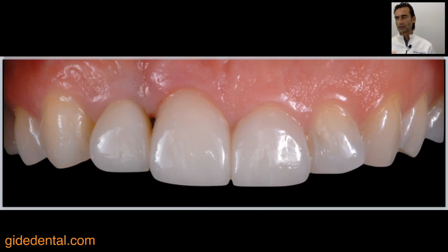clinical condition, you can see here the central incisor that has a healthy band of keratinized gingiva, has a good circular position, but of course in comparison with the number 9, which is very short, this condition is somewhat on a more apical position.